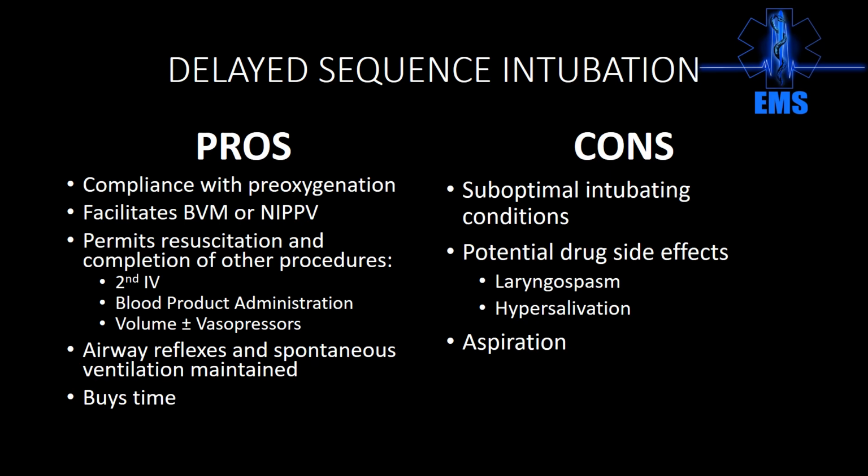There's something else. It allows the patient to retain their airway reflexes and spontaneous ventilation by not paralyzing them. But most importantly, it buys you time. It buys you time to get stuff done and, again, to resuscitate that patient.